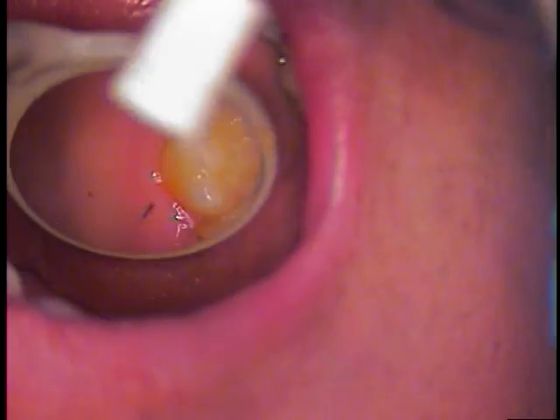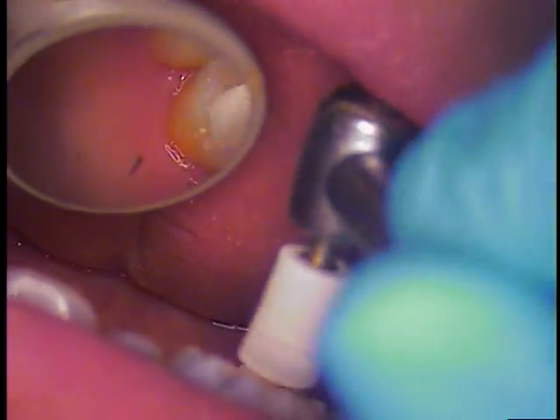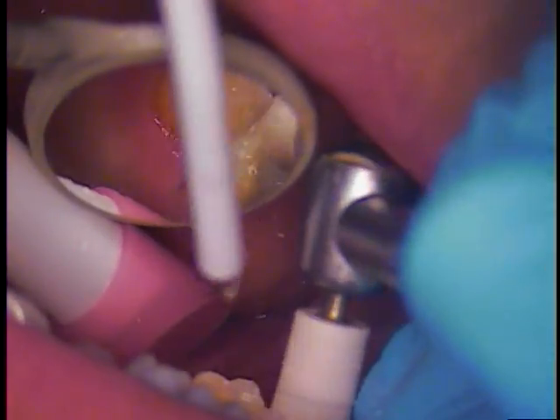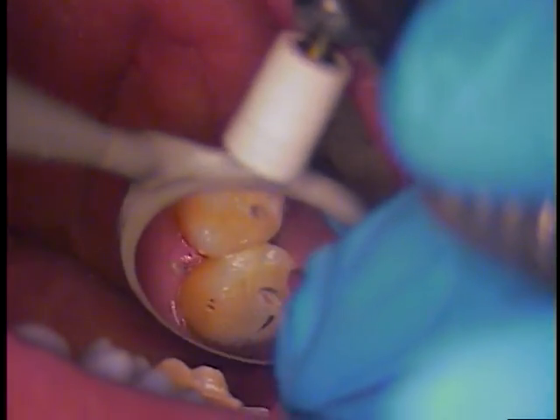It's pretty flexible. Last thing I need to do. Just about done here, almost finished — just going through the last step for the patient. And we'll send some floss through there next. A little floss coming in, and it snaps through nice.